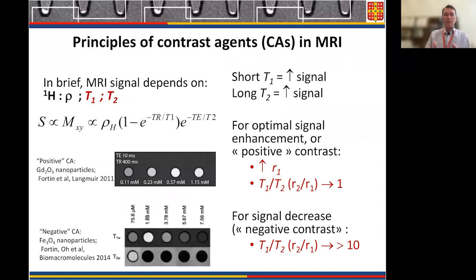So, with all this, when a chemistry laboratory dedicated to contrast media research wants to demonstrate whether or not a contrast agent is ready for injection in vivo, one of the typical tests is the contrast media test using MRI.